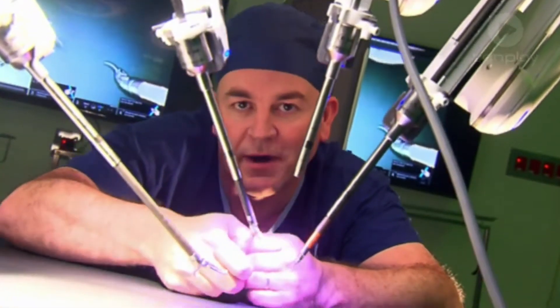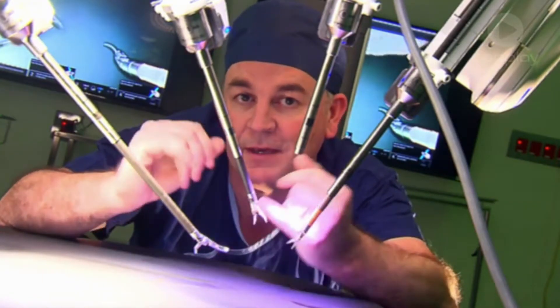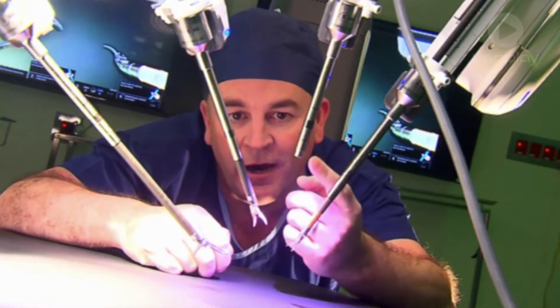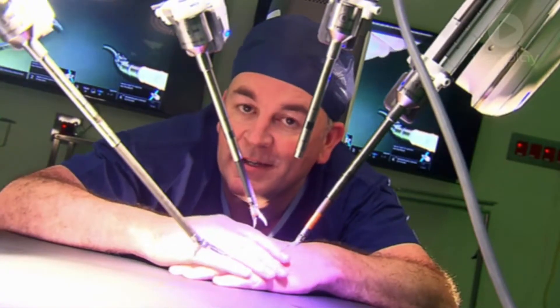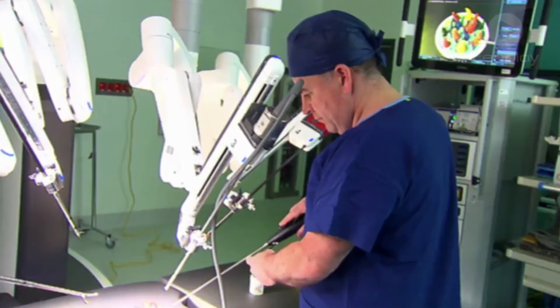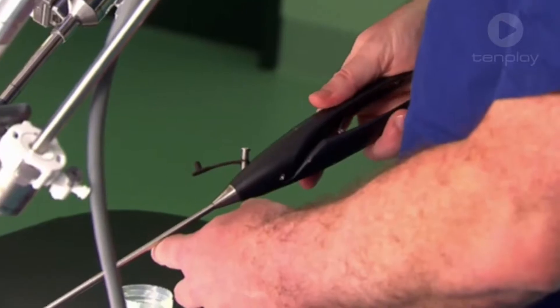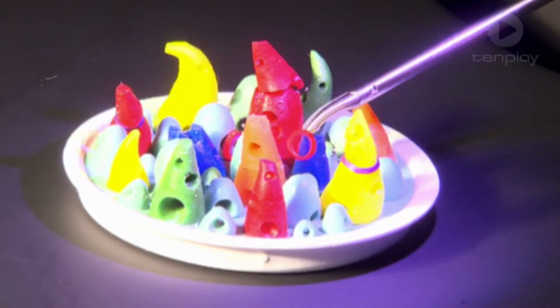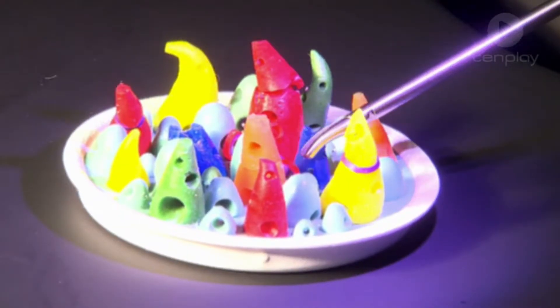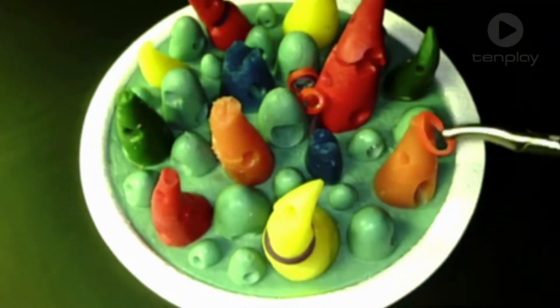Surgery conducted by our robot is done with keyhole incisions, meaning we only make tiny holes for the robot's eyes and hands to go deep inside the body. This is much safer and much more comfortable for the patient. With standard keyhole surgery, instruments are operated by human hands, like chopsticks. As you'll see here, it's a really tricky process, unlike the smooth wristed movements we have with our surgery robot.